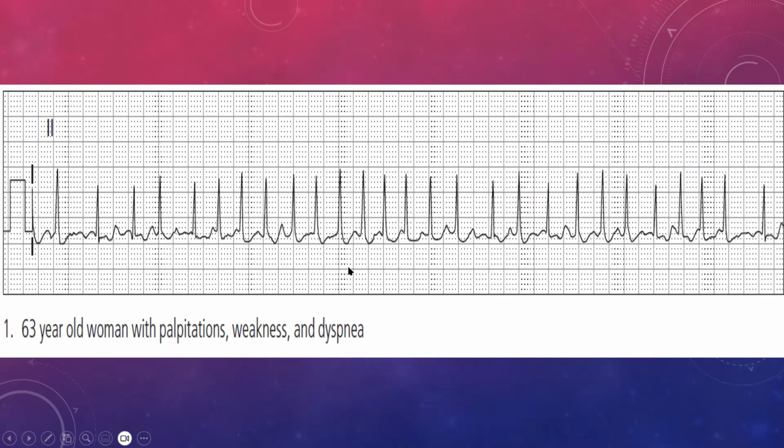So the common misconception amongst a lot of people, and I just want to draw this out, is that if you get atrial fibrillation, it must look like this. You know, it must be a jagged line that you can't make out anything. And then you get a QRS complex, and then you must have a jagged line again, and then another QRS complex. And that's basically what it must look like for it to be considered atrial fibrillation.